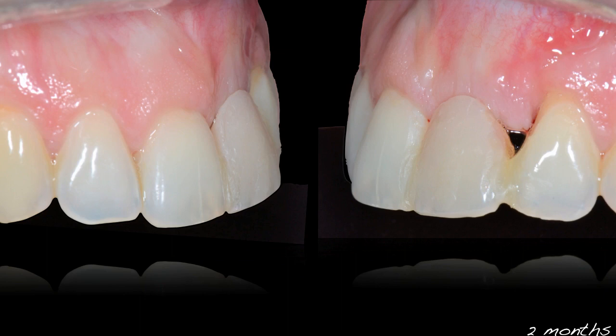And now at the abutment connection, we decided not actually to place a connective tissue graft, which you can criticize on that or not. Since we knew that we would have a great contour of the teeth, we could have probably placed a connective tissue graft to bulk it up a bit more, but in this case, it wasn't necessary.